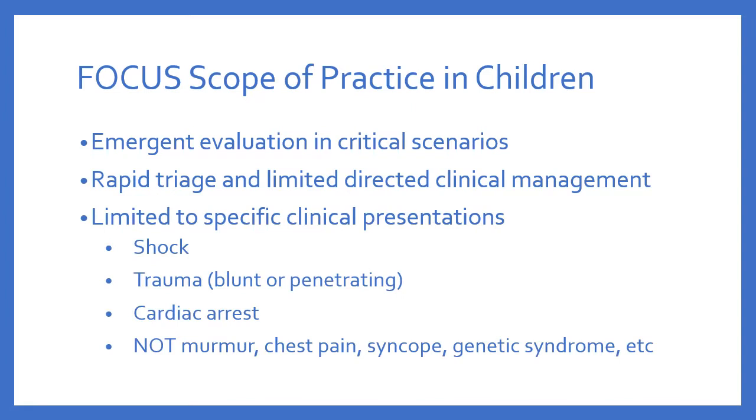It's typically limited to specific clinical presentations in children. So in the setting of shock, focus can be immensely useful. In the setting of trauma, whether blunt or penetrating, we can use focus. And then during or immediately after cardiac arrest, we can often find out more about what's going on with our patient. But it is really important that we don't use focus outside of this scope.